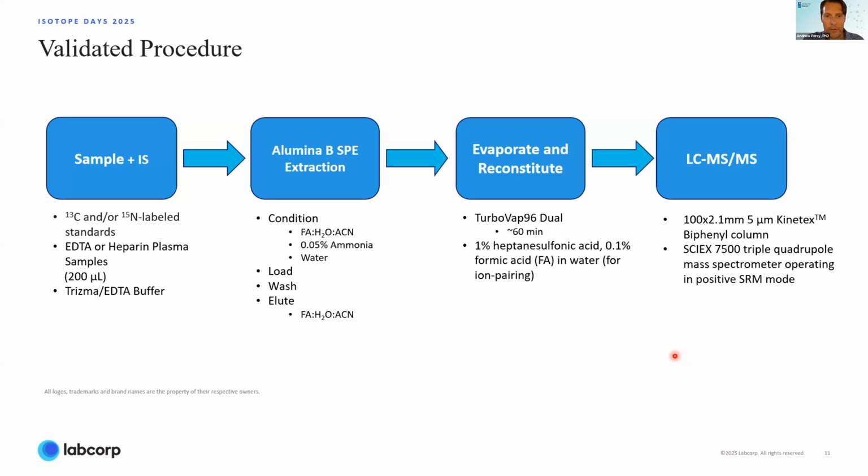Then the final question from the audience is for the PCAT stability, did you consider adding any preservatives to the collection tube? We couldn't add preservatives to the patient collection tube. However, we did add preservatives to the calibrators and controls to give them extra stability.